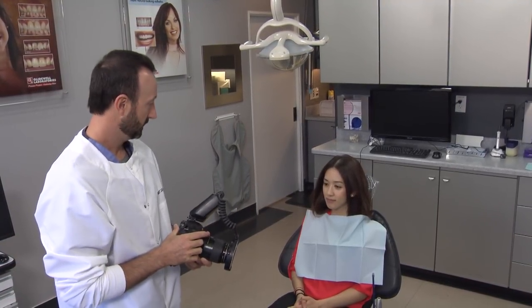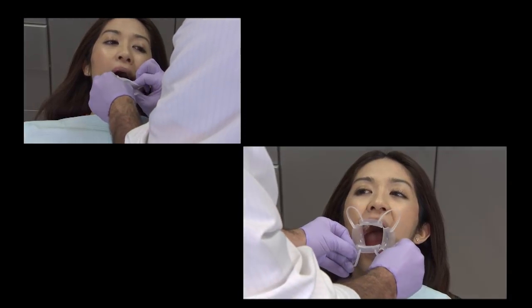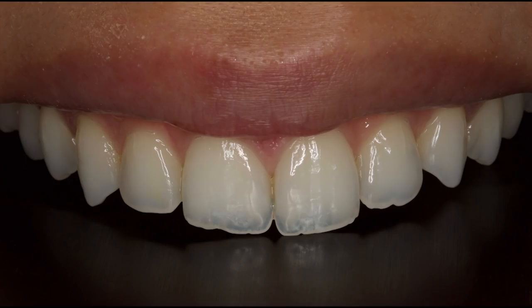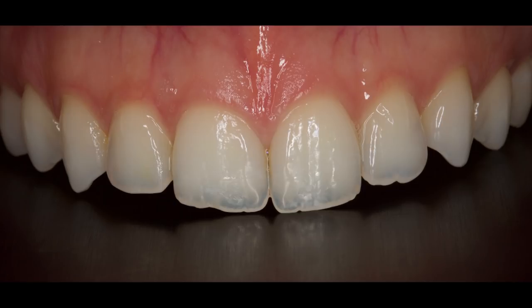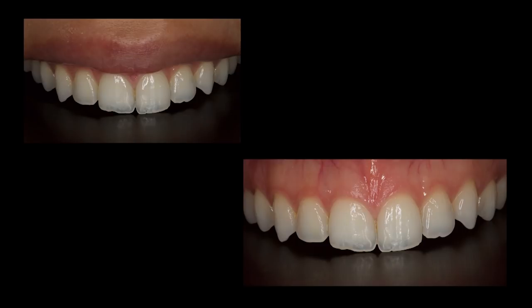To remove extraoral distractions such as the lips, cheeks, and free gingiva, a multitude of different retraction devices are available to assist the photographer. Block out devices, such as an intraoral contrastor, may cut away even more distractions such as the tongue, throat, and shade variances while highlighting the subject area of the mouth and focusing the eyes towards them. These contrastors can be used with or without lip and cheek retraction as needed.